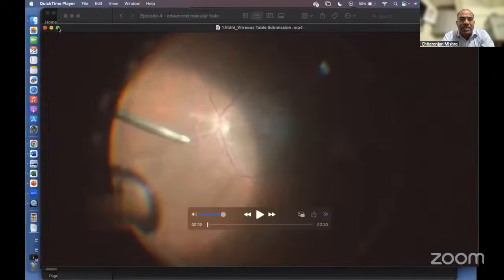So, basically, wherever the macular hole is not a simple small one, not like the traditional senile one of less than 400 or 500 or 600, in only those simple cases can we escape with a traditional ILM peeling. But in other cases, we have to go for an inverted ILM peeling. That is my practice. Okay, I think some very good points you brought about, Chitranjan, especially about myopic holes.